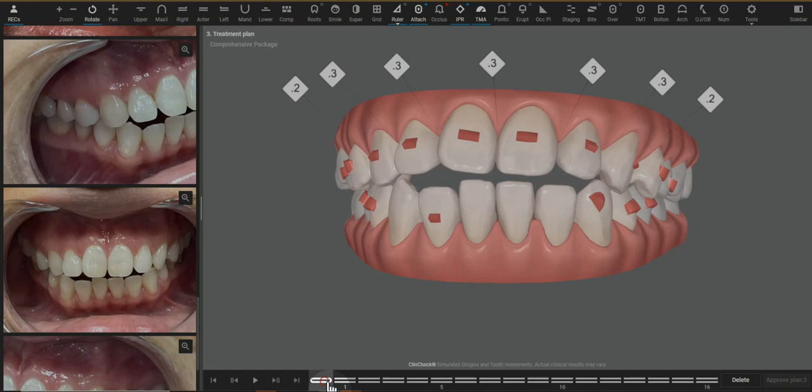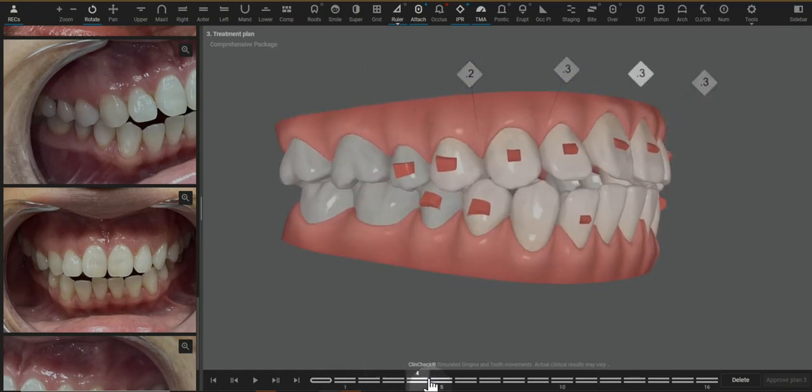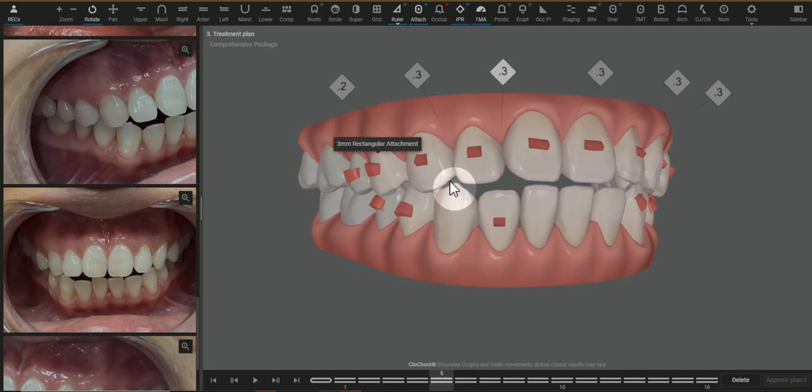When we are attempting to do this extrusion movement, although we have the active engagement of the aligner on the optimized attachments, what can happen is if the teeth are resisting — not necessarily due to bone pressure, but there's a PDL and multiple teeth moving — without these retention attachments, the aligner starts to slip off or disengage, and then these anterior attachments become essentially useless. So maintaining premolar or molar retention attachments is really key.